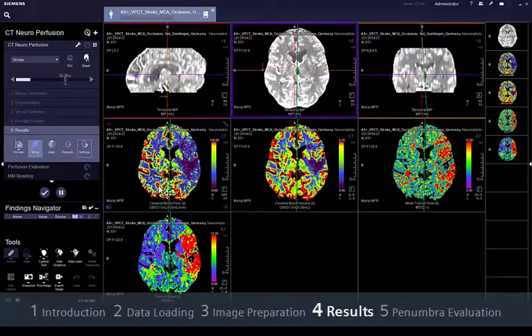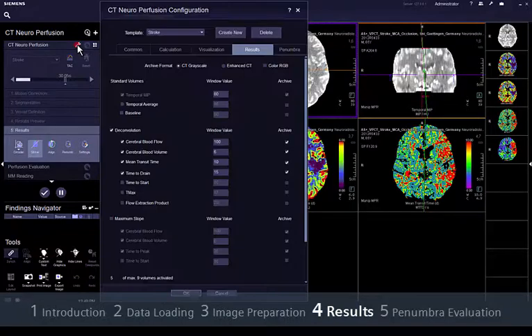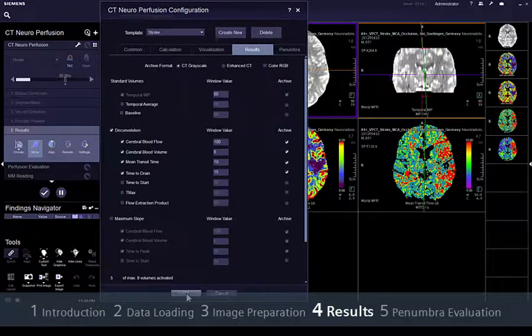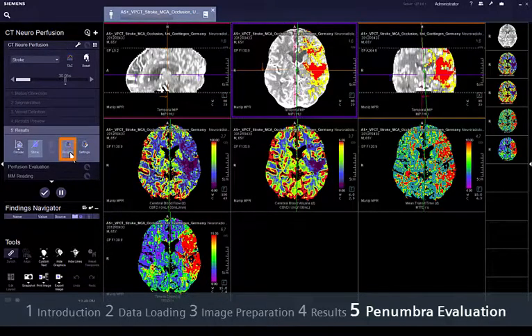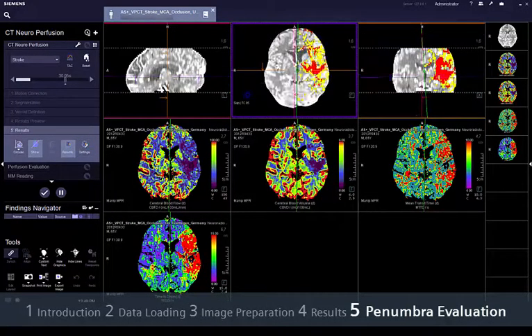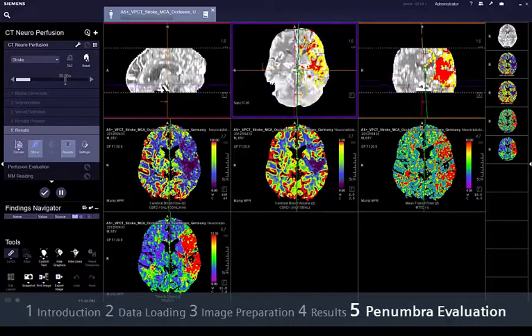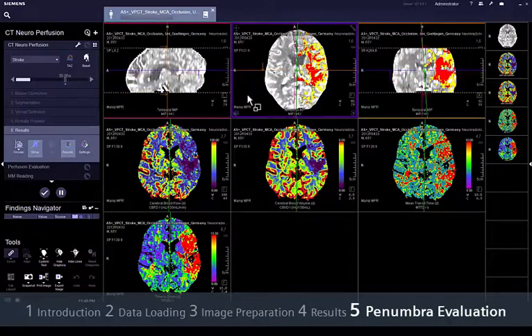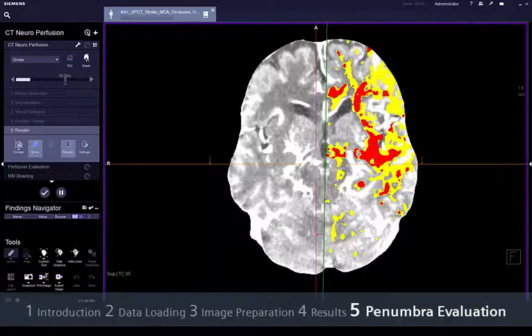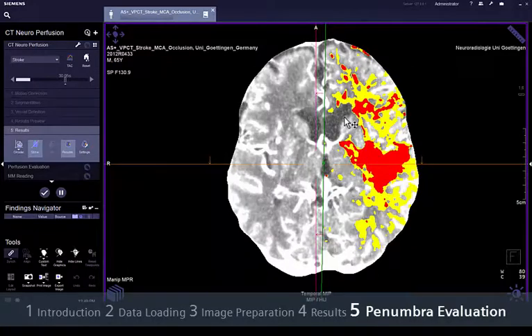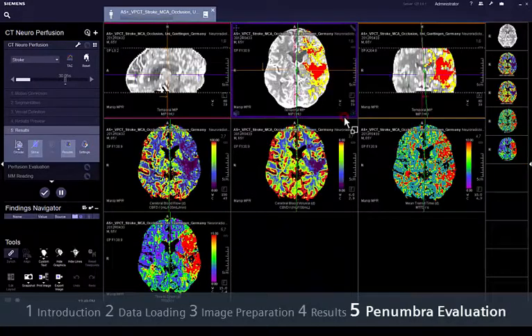More parameters can be added in the configuration dialog. The penumbra region of a cerebral infarction can be evaluated for an optimised treatment strategy, including tissue at risk characterisation. This mismatch is depicted in red and yellow using CBV and CBF thresholds.